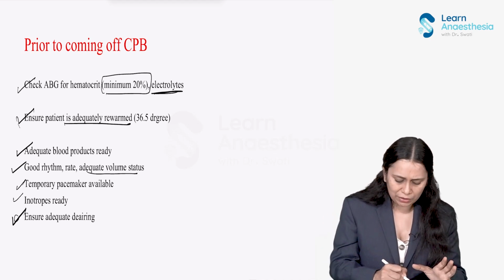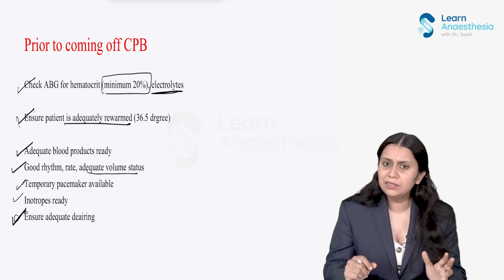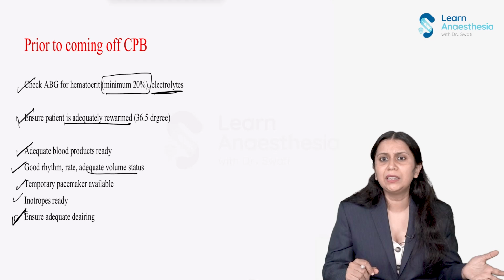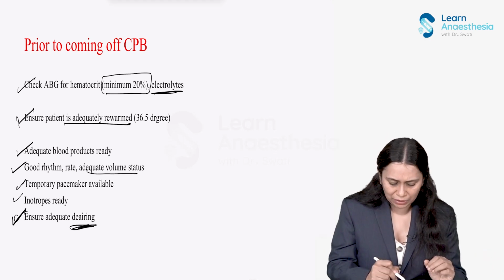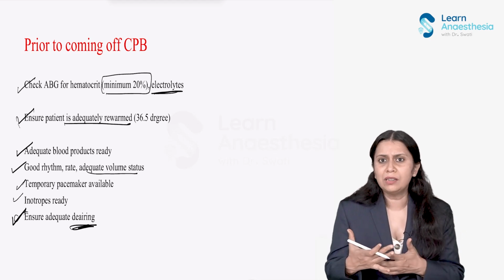And adequate de-airing should be checked for. We should check for adequate de-airing of the entire circuit. Now, this can be done through the transesophageal echocardiography. So, centers check for any remaining air through transesophageal echocardiography. So, adequate de-airing should be there. Okay. So, these are the important precautions we need to take when the patient is coming out of the CPB.